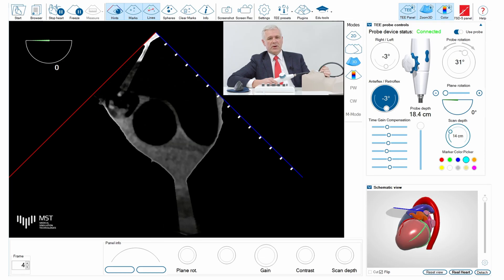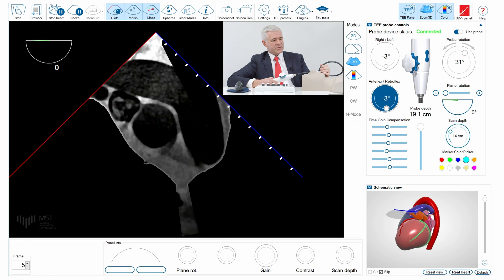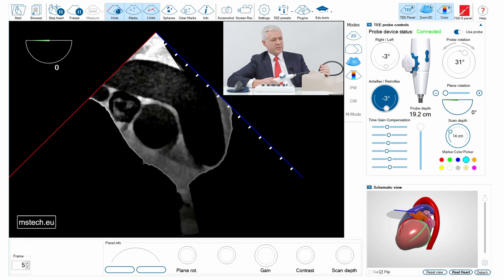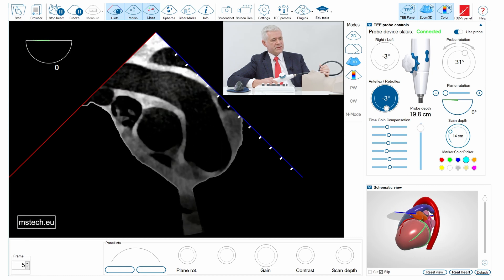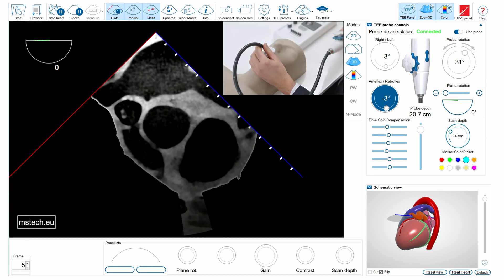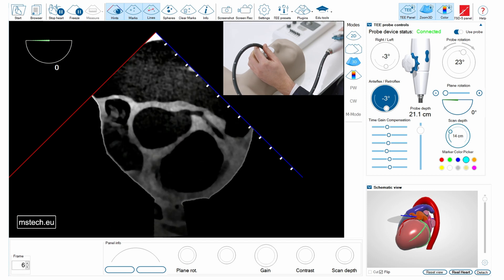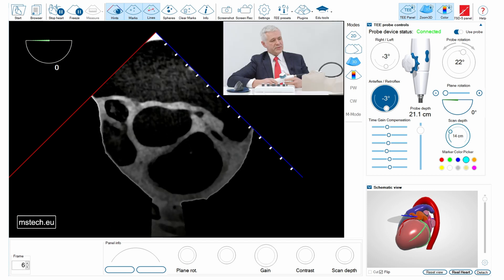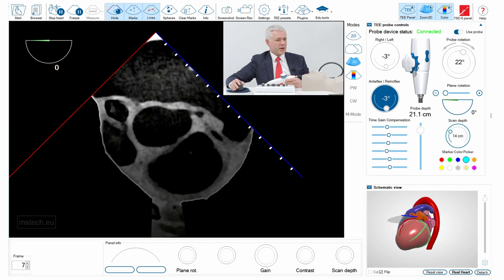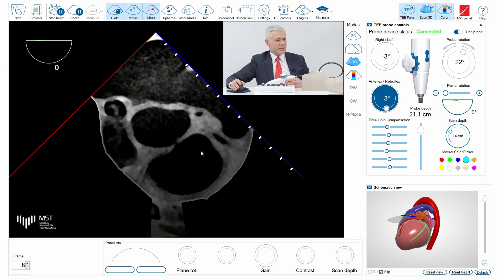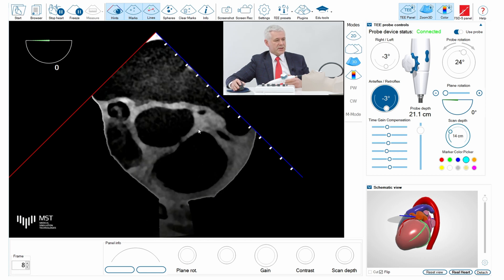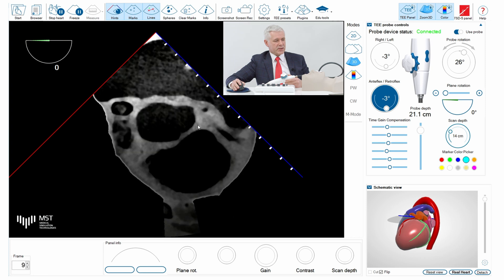The case has been loaded and here you can see the upper esophageal views with the big vessels visible. Going down, you can see the orifice of the left main coronary artery with the bifurcation, and at the same time the aortic contour has become oval.